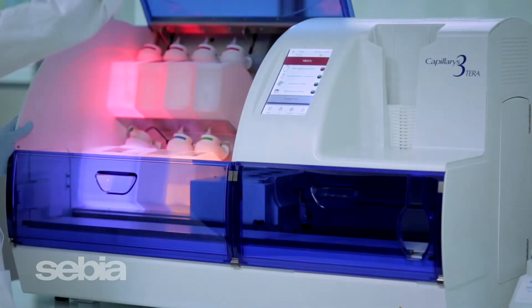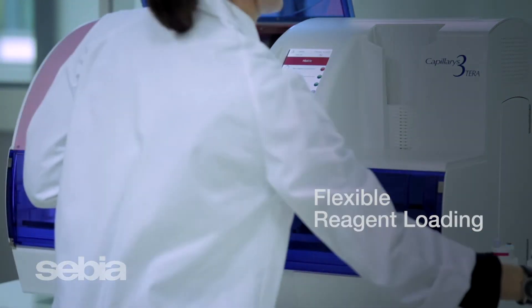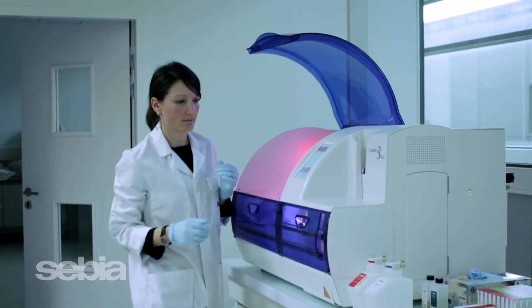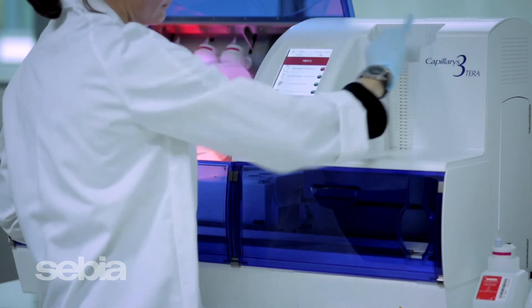All reagents are ready to use. Load up to four unique buffer types simultaneously for workflow flexibility and effortless switching between assays. To reduce instrument interventions, preload the system with sample dilution segments for continuous processing.